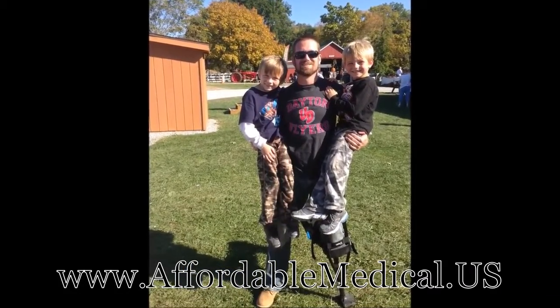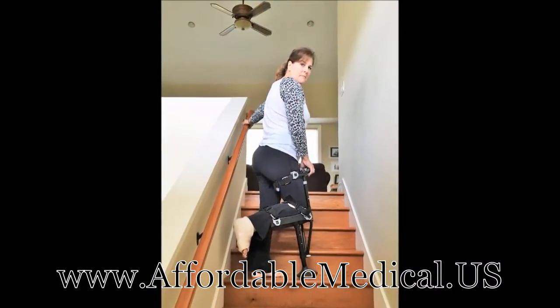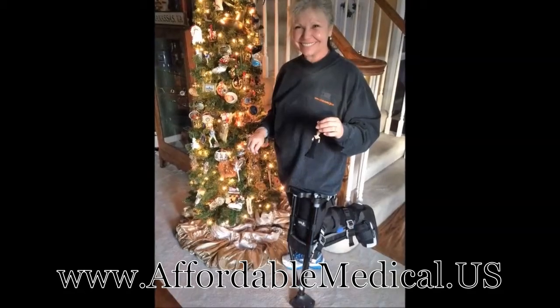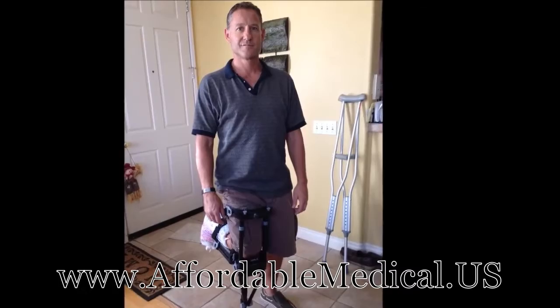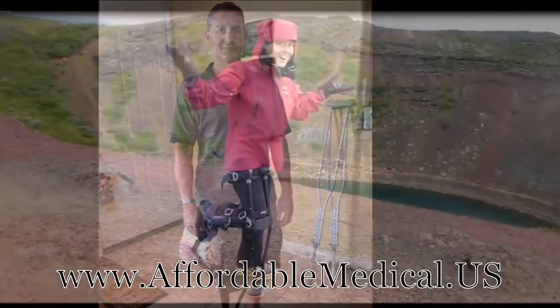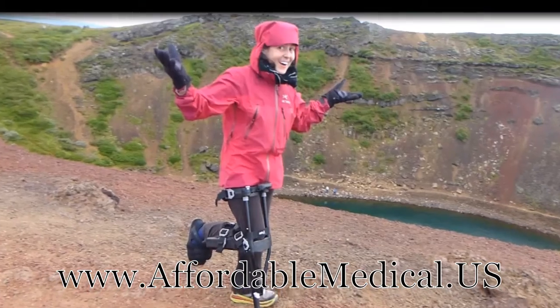For your first steps, you might be a natural, but you might not. So why go it alone? Do yourself a big favor and watch our videos before you get started. We'll show you how to assemble, fit, and take your first steps on your iWALK crutch. That's what these people did, and now they're going to show you what happens when you do the same.